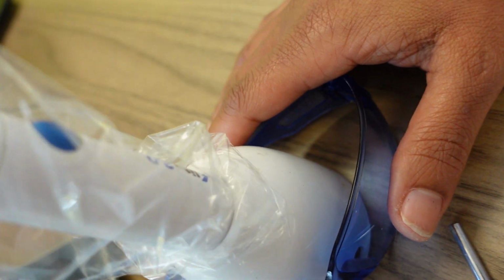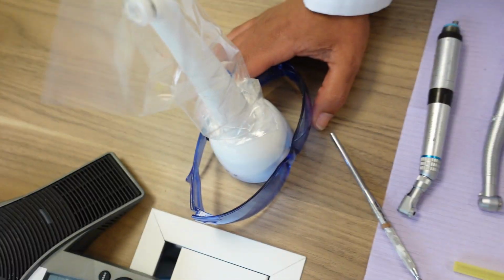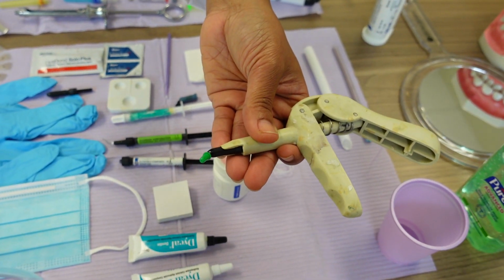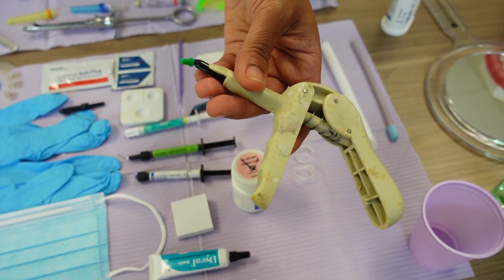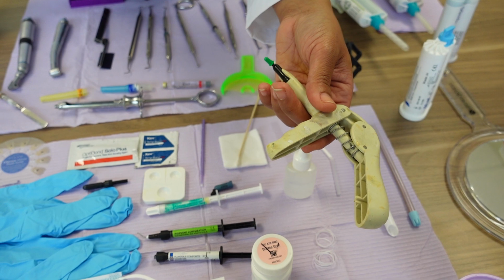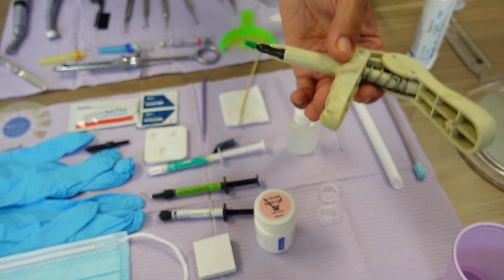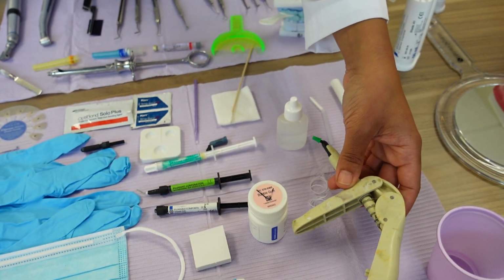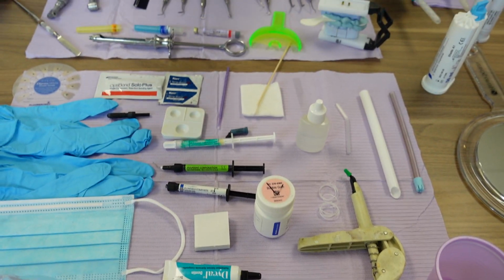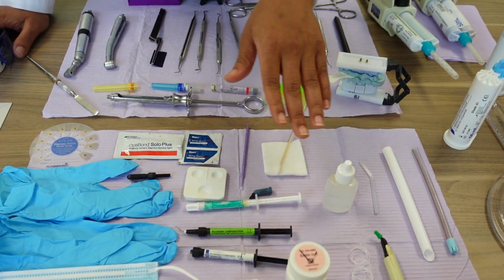Now we're going to pretend that we don't have core buildup material, because we're going to move over here, which is composite. So dental assistants out there, don't panic if you're working on a crown prep and you don't have any material. Oh my God, I don't have any core material. Ask your doctor, Doctor, is it okay, because it's on back order, we can use composite? Sometimes they will say yes, sometimes they will say no. But don't think it's the end of the world just because that happens. But guess what? As a dental assistant, you need to not run out of anything.